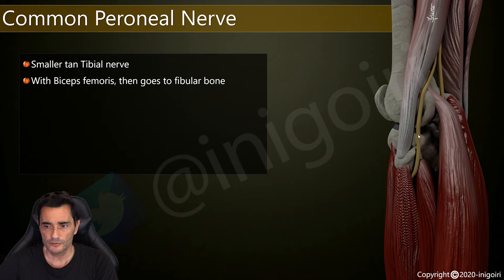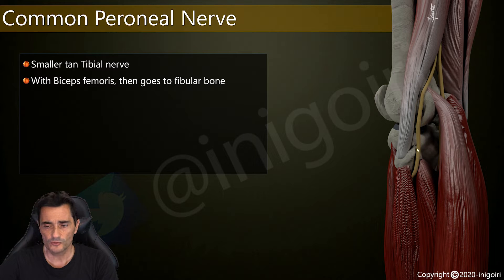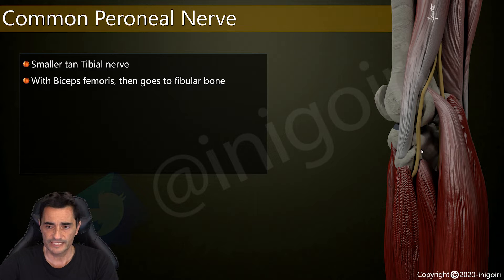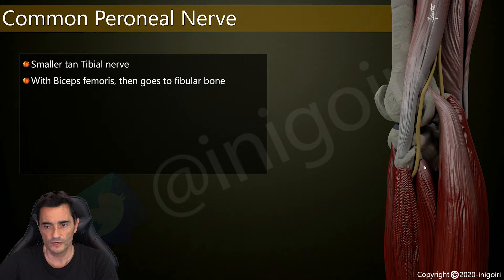Follow the common peroneal nerve and look closely where it reaches the fibula and the head of the fibula, because at this level there is only skin, a small amount of fatty tissue, and connective tissue surrounding the nerve, with the bone as the floor. It is very easy to damage here — with casts, compressions, traumas, or even with cysts or ganglia originating from the proximal fibulo-tibial joint. This is a very common area of injury.